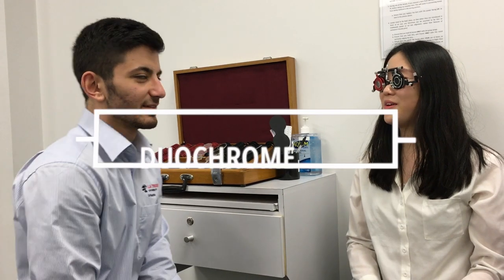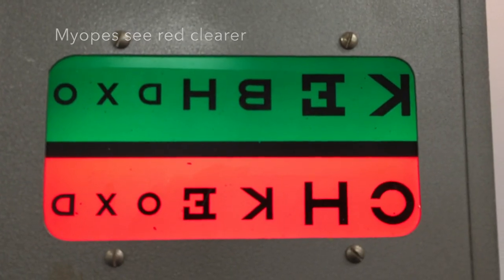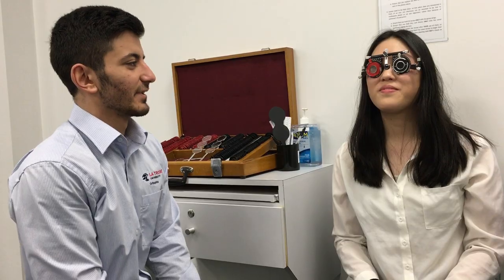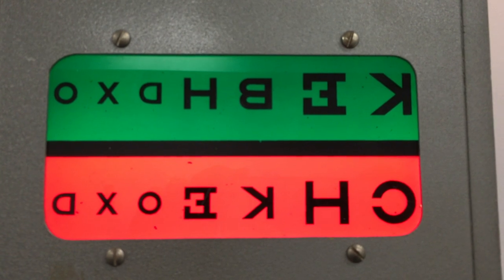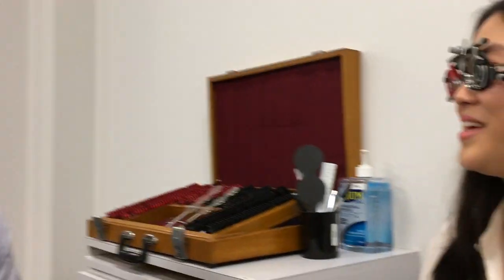The duochrome test is performed. Susan is asked whether the letters are clearer on the red or green background. She reports the red is slightly clearer, indicating she is slightly undercorrected, which is the target outcome for myopes. The examination is then concluded.